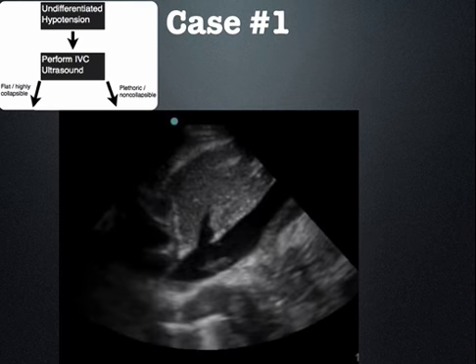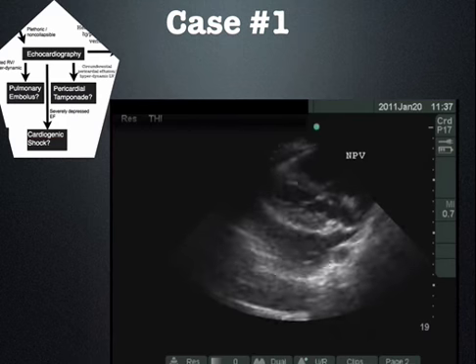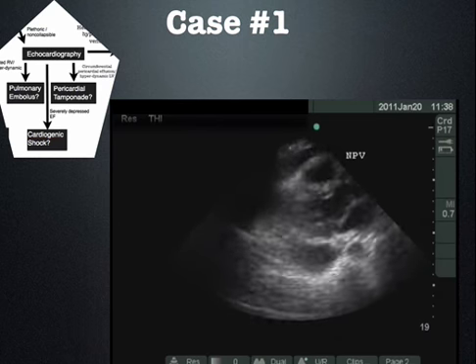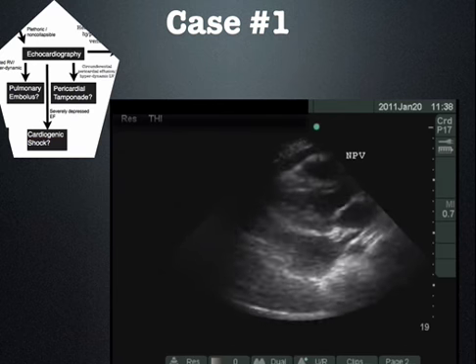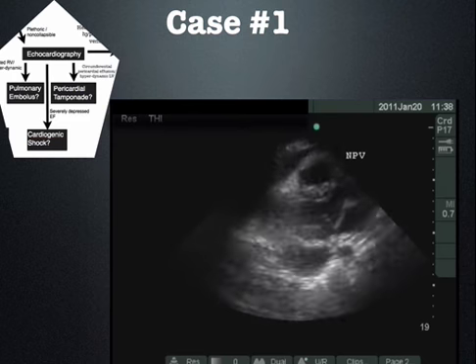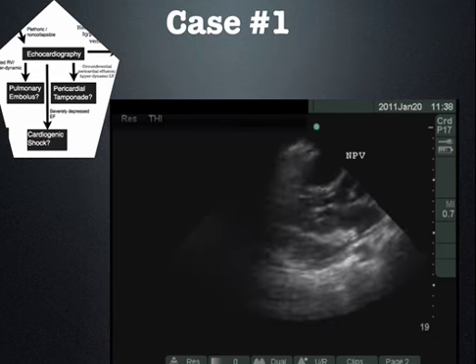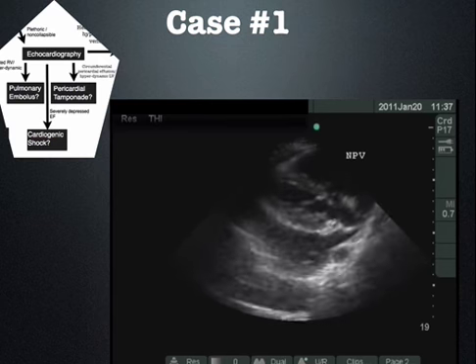So for me, in my mind, I'm going to take a look at the pump because there might be a problem up around the pump. All right. This patient has a large circumferential pericardial effusion with a dilated IVC. I'm going to treat this as tamponade. Now, the patient was mentating well, so I went ahead and gave the cardiologist a call. They came in, took a look at it, and said, yeah, they do some more complicated measurements. They look at mitral valve inflow velocities, and they can see variability with respiration, much more complicated assessments. They said, yes, this is tamponade.